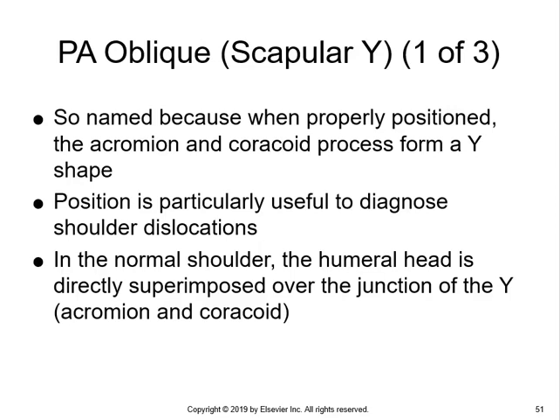I drew the Y view out on the board and talked about where we could make a diagnosis with the Y view as opposed to other views. We'll cover this and then we'll back up and talk about the other Lawrence method, which was the inferior superior axial. So the Y view is named because it actually looks like a Y, and we'll take a look at some images here in a minute.